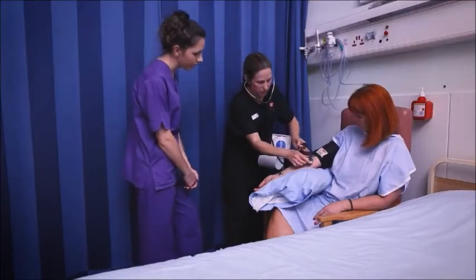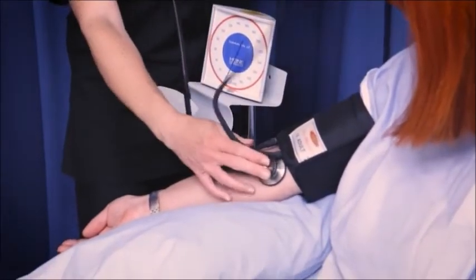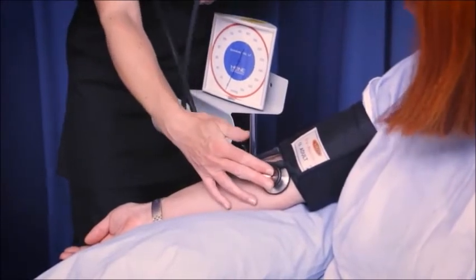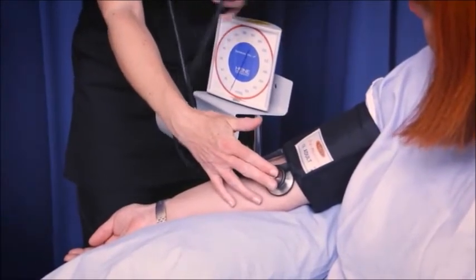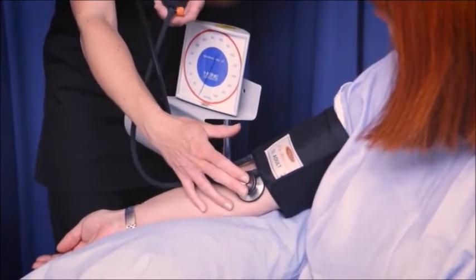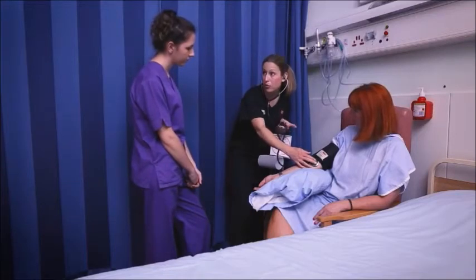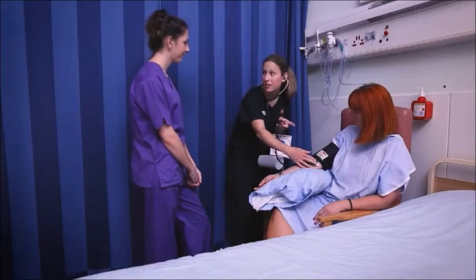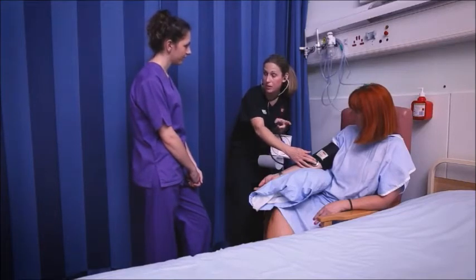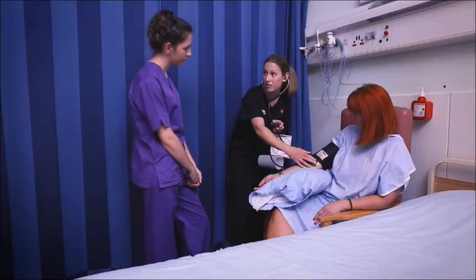So now for the next step, I'm going to use the diaphragm over the area of the brachial artery. And this time, when I pump this up, I'm going to pump it up to about 20 to 30 millimeters of mercury above the estimated systolic reading. And then I'm going to let the cuff down very gradually to take the measurement. If you remember, there's two sounds to listen for. The first tapping sound is the first Korotkoff sound, and that's the systolic reading. When the sound disappears, that's the fifth Korotkoff sound, and that's when we take the diastolic reading.